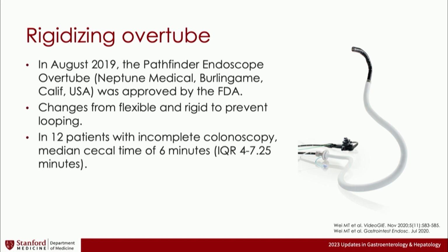In one case series that we performed here at Stanford as well as the VA Palo Alto, we looked at 12 patients with incomplete colonoscopy. In all these cases, with the utilization of the rigidizing overtube, we were able to achieve cecal intubation, with a median cecal time of 6 minutes.